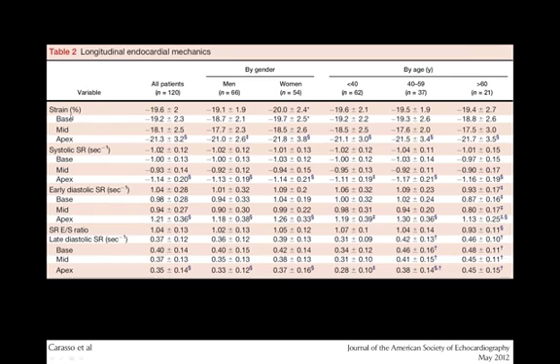So here, all patients, and this is 120 healthy normal volunteers, their normal range was 19.6 plus or minus 2. So that brings the lower limit of normal to 17.6, and that's basically why I call it normal if the longitudinal value, in our lab, is 18.